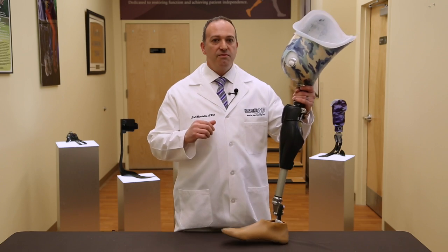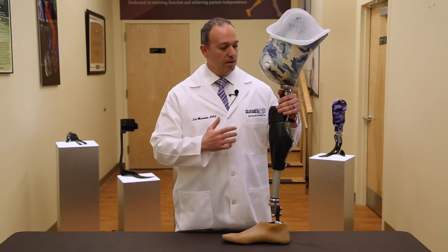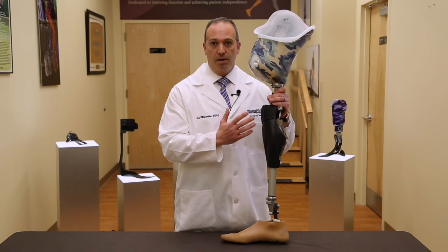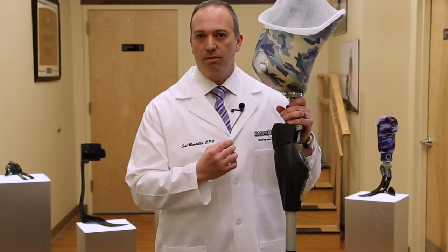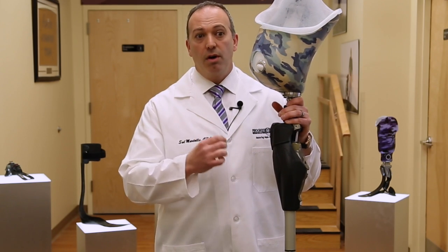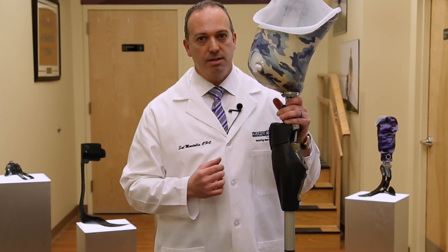This device is very fast and very stable, which is why I truly love this device for all of our above-knee amputees. This is for above-knee amputees who want to reach the K3 level of function, or are at the K3 level of function and want to demand even more out of their prosthesis.